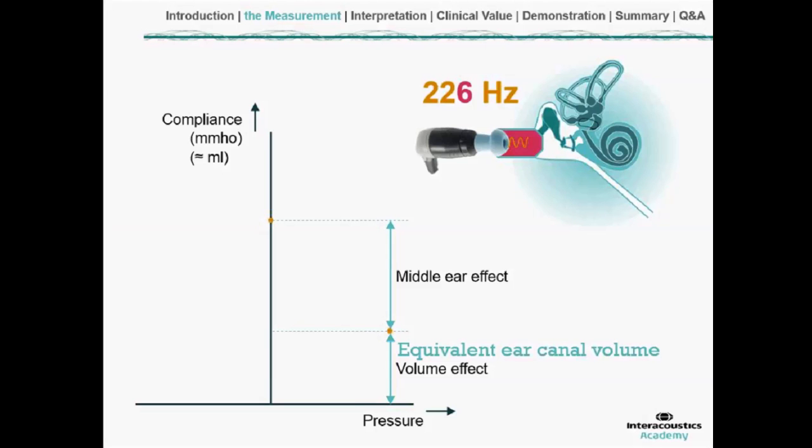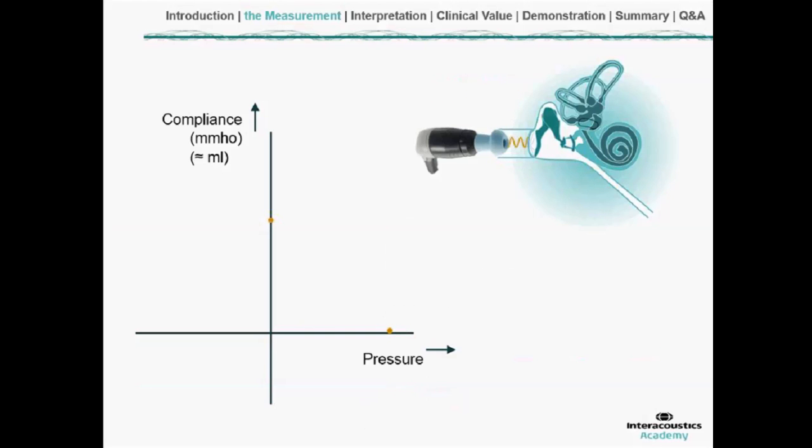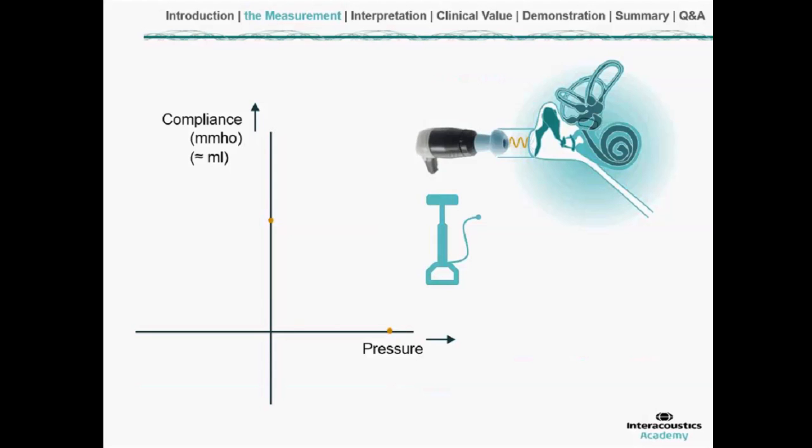So what happens is we move the pressure axis up to that point. And by doing so, tympanograms become a lot more comparable. Good. So let's now see if we continue a true measurement. We have moved the pressure up to the positive point, and now we're going to use the pump and pump all the way to the negative part.